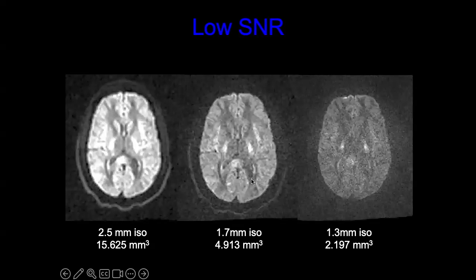So now this piece of white matter at this resolution, you can still see that the signal's gone down, but it looks higher than that background noise. You get to this resolution, and you can't tell the difference between that and the background noise. So now all you're going to be calculating is the noise when you try to get your parameters.